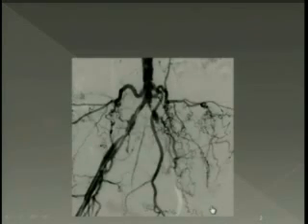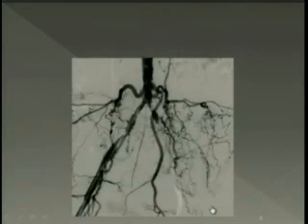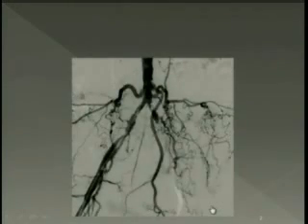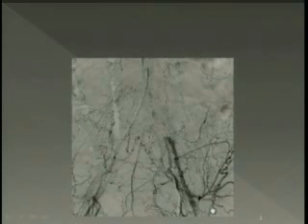We have critical disease on the right iliac and a total obstruction of the left iliac. Left iliac, however, you see the reformation and the distal vessel beyond the internal iliac. That looks very good, and it's a fairly clean distal vessel. So you have sort of a disease which is limited to the origin of the iliac and onwards.